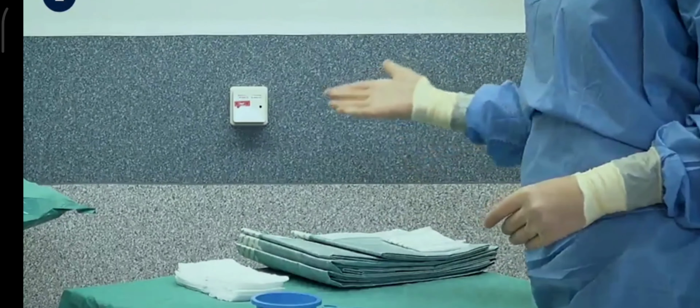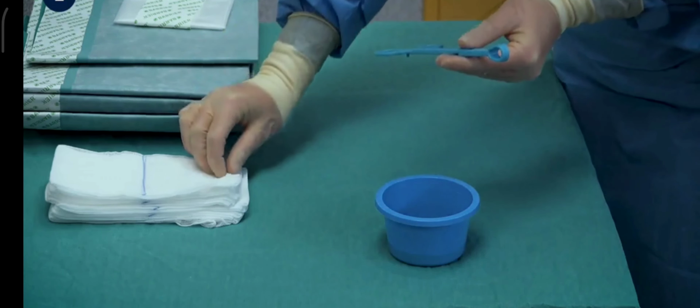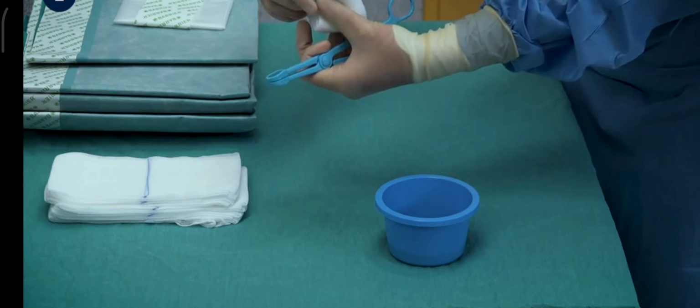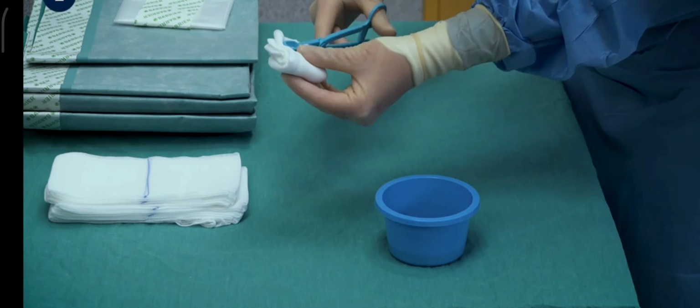Take note of the drapes, sterile gauze swabs, clean container, and clamp. An example of how to load the clamp is now shown. A gauze swab is folded and then placed into the teeth of the clamp. This can then be used to clean the patient.